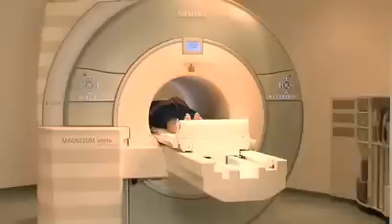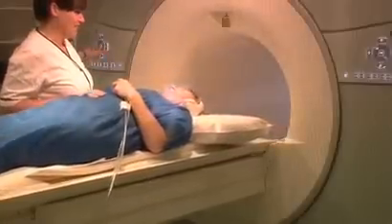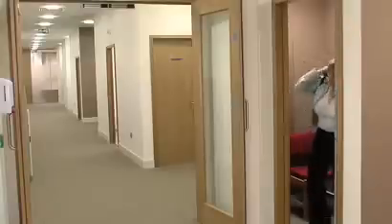Scanning one part of the body normally takes about 15 minutes. The duration varies depending on the part of the body being scanned. Euromedic reports the results of the scan to your referring practitioner, usually within 48 hours.